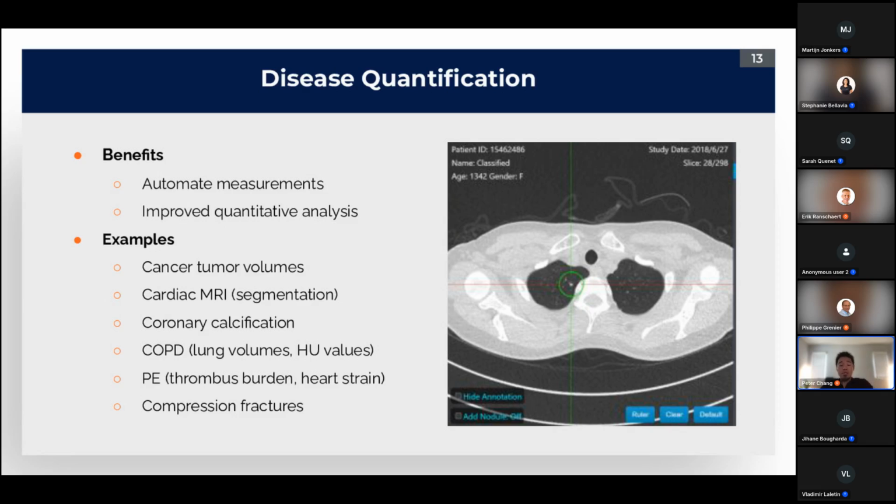Quantitative 3D volumetric measurements have always been possible. They're things that are technically visible on the image, and with enough patience, humans can do these same measurements as well. It's simply not practical without the aid of machine learning.